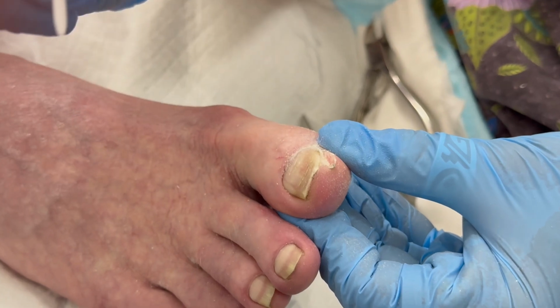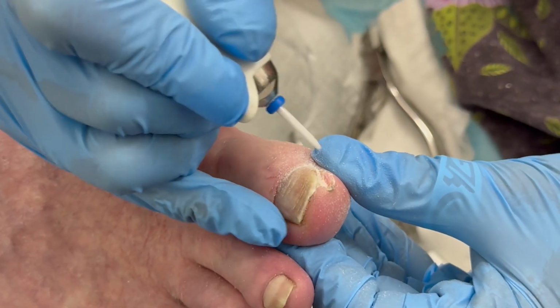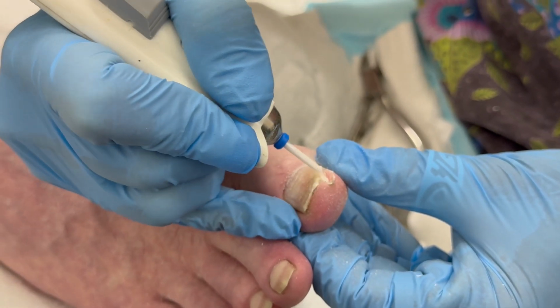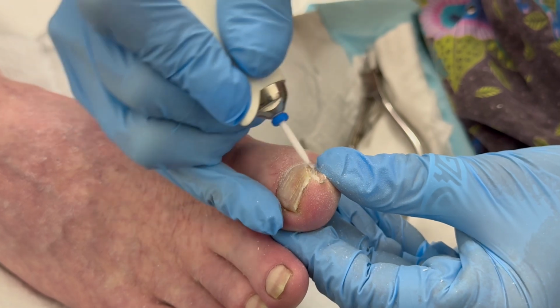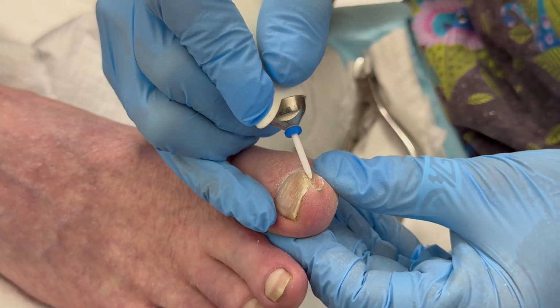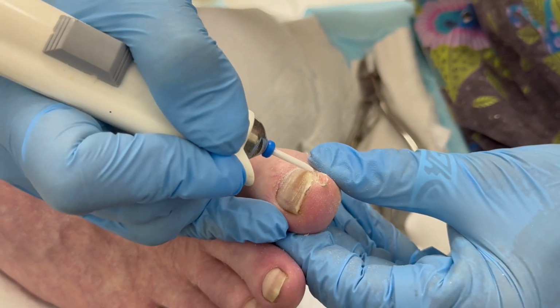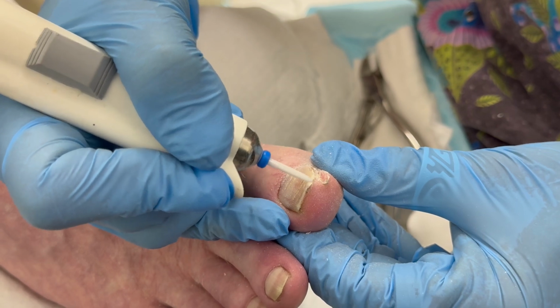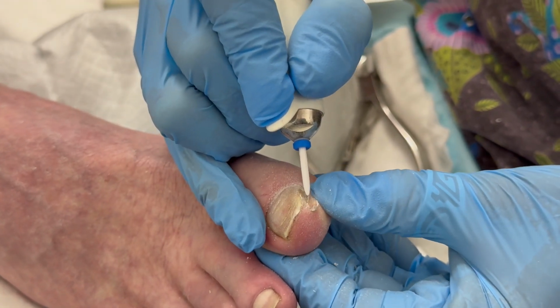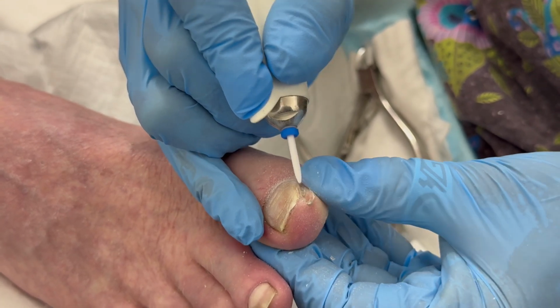So now I'm going back up. I call this technique up the inside. So we're going up the inside. I can thin out this. Thin out that. Okay, I can press harder on the denser areas. And then I'm going to try to pinpoint this area is where it's causing him the pain, right in there.